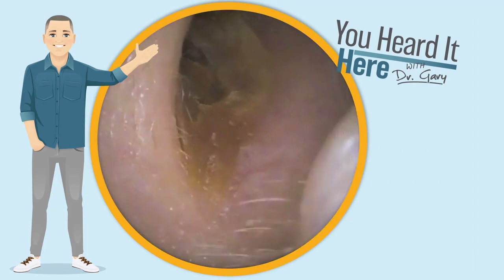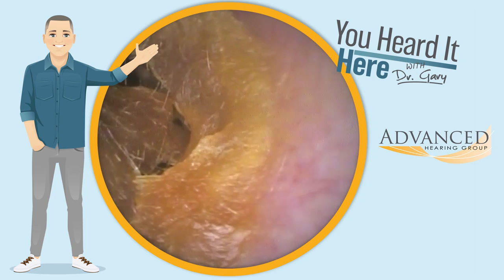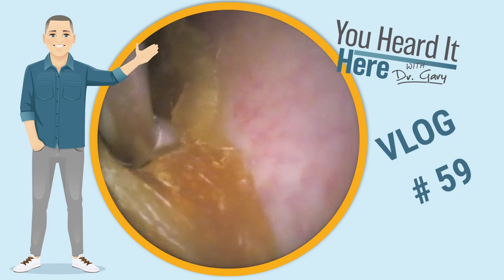Welcome back to You Heard It Here with Dr. Gary. I'm Gary, one of the clinical audiologists and part of the ownership team here with Advanced Hearing Group in Scottsdale, Arizona. This is earwax removal vlog number 59.